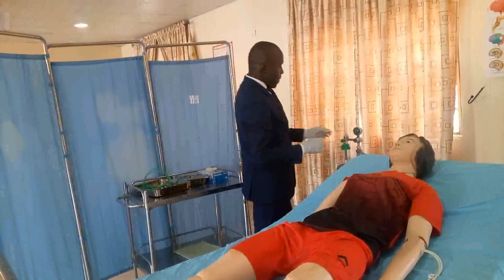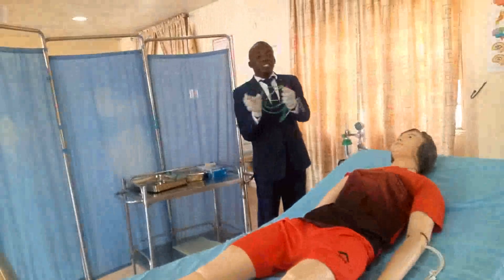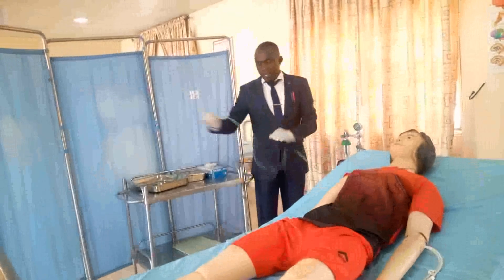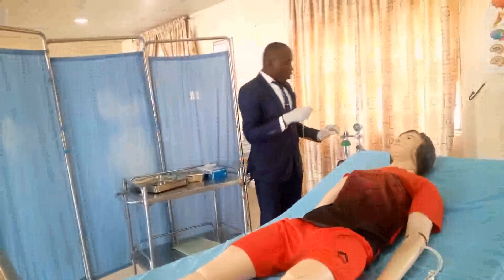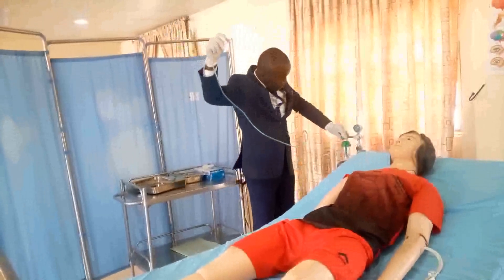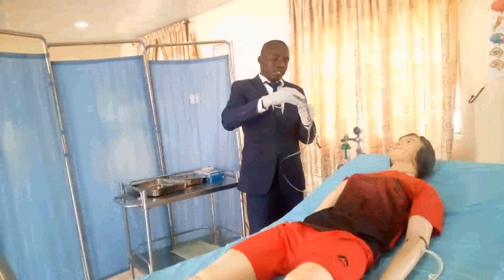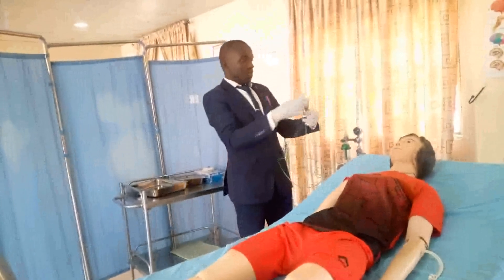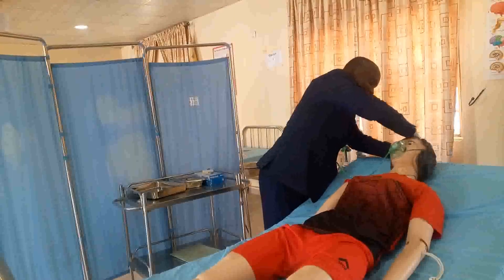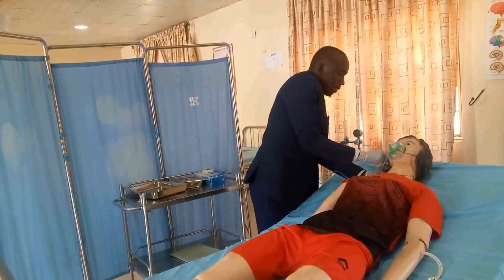You have your humidifier. Attach the humidifier to the oxygen cylinder. Then take the connecting tube and connect it to the humidifier. Hold it to check if there is any leakage or damage. Then place the mask on the patient's nose and mouth, and secure the strap to the back of the patient's head.